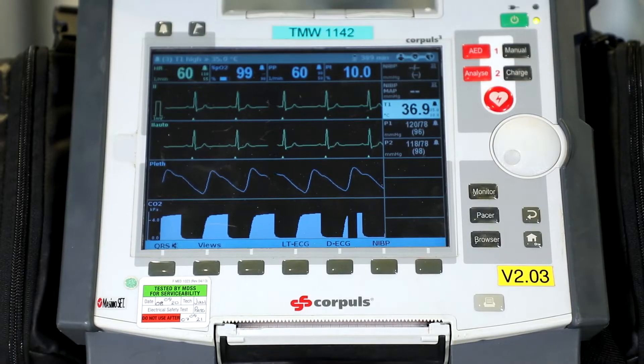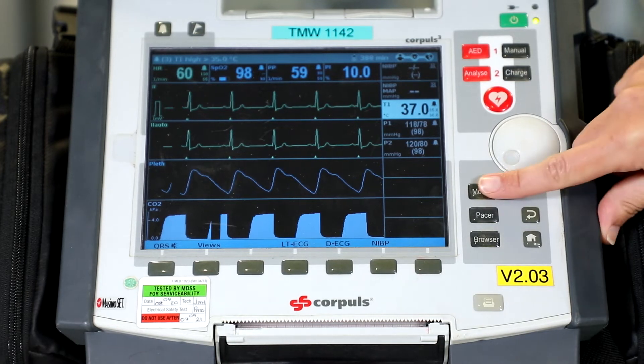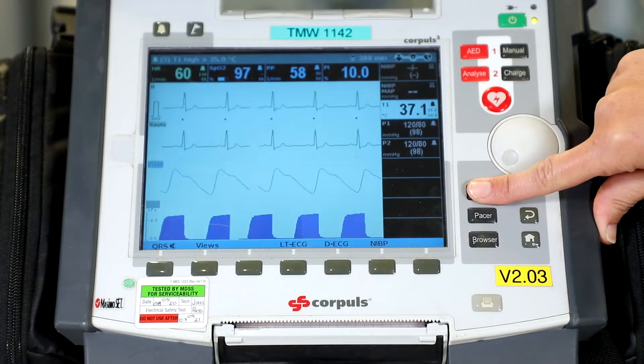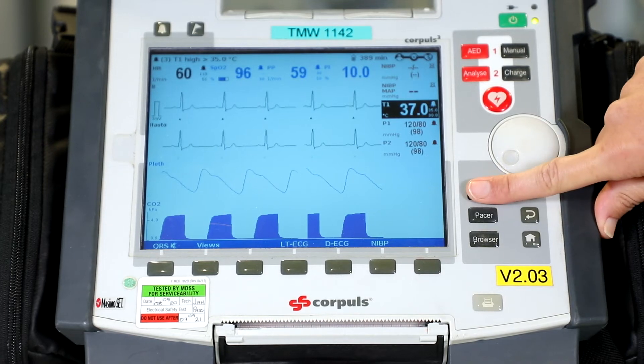Once we have done the Corporal physical checks, we can move on to the general functional checks. The first thing is to invert the screen — press and hold the monitor button. This might be useful if you've got glare on your screen. To revert, press and hold the monitor button again.